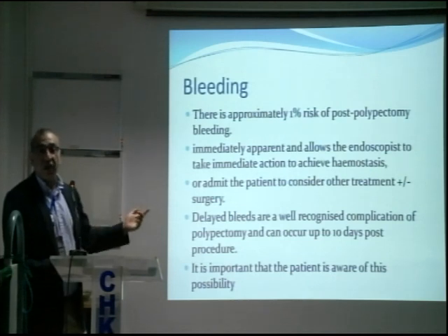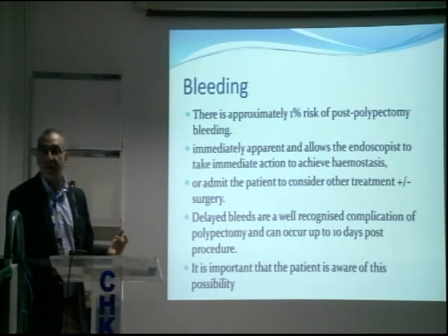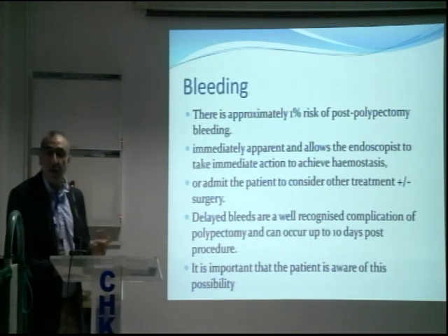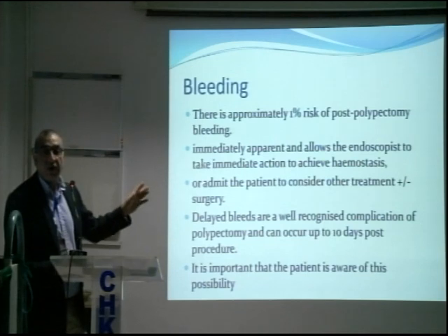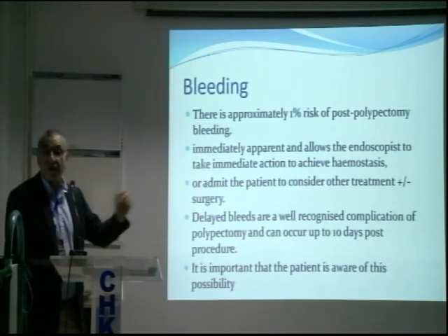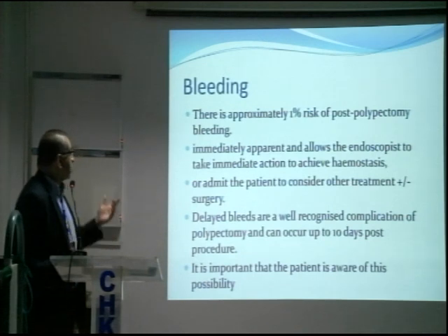Secondly, you should have facilities for hemostasis available to you, whether it is in the form of gold probe, heater probe, hemoclips, hemospray, whatever. You should have them available with you during the procedure. You shouldn't have people running around looking for things at the time of bleeding, because your window of opportunity is very small.